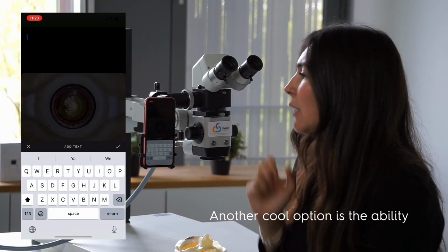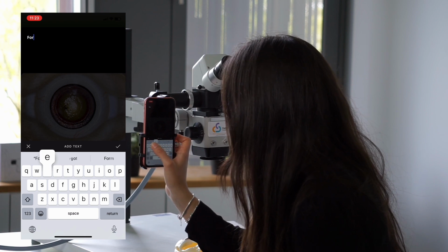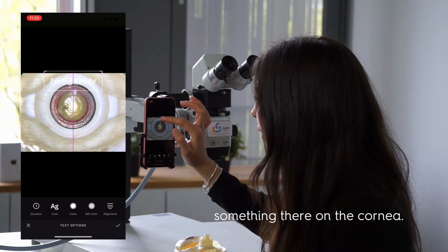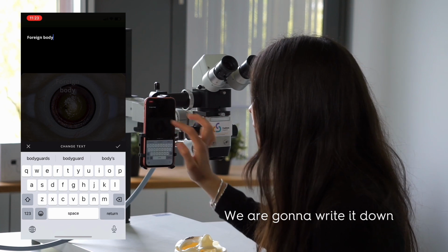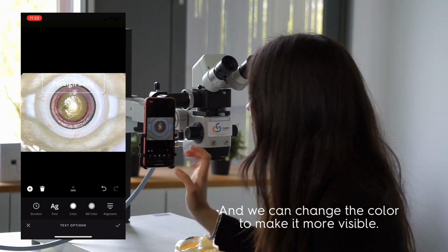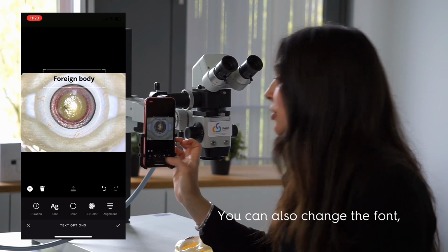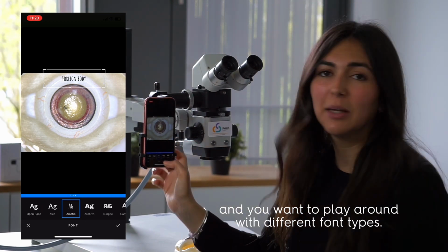Another cool option is the ability to write text on the video. So you can write, for example, foreign body. We can see there's something there on the cornea, so we are going to write it down to let people know that there was something there. And we can change the color to make it more visible. You can also change the font. If you don't like this font and you want to play around with different font types, feel free to do it.